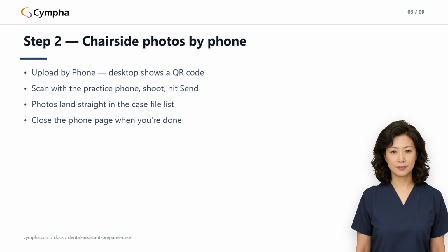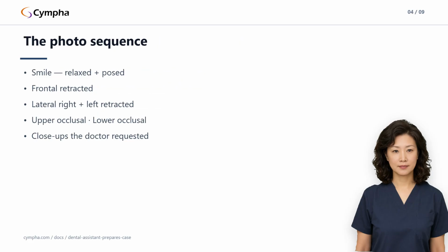The smile, relaxed, and then posed. The frontal retracted view, lateral right and lateral left, retracted. The upper occlusal, then the lower occlusal. And finally, any specific tooth close-ups the doctor asked for when the visit was booked.